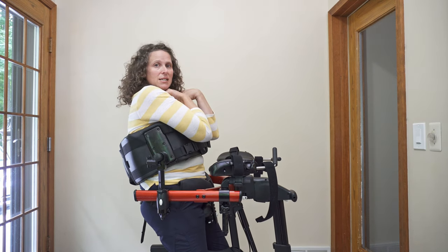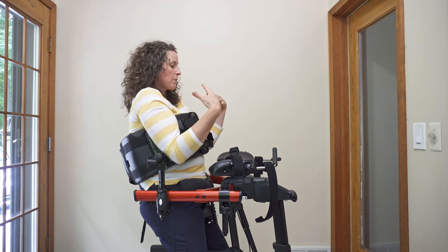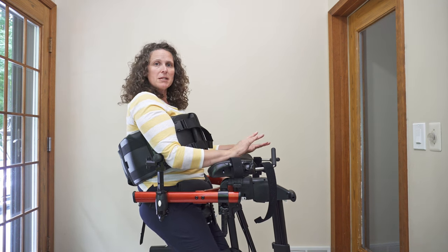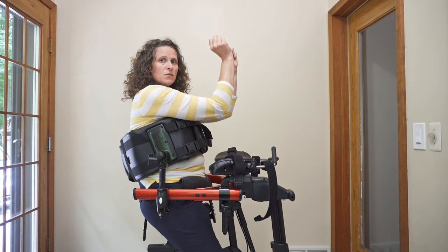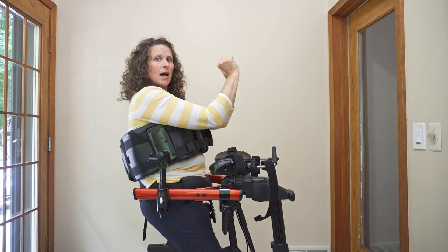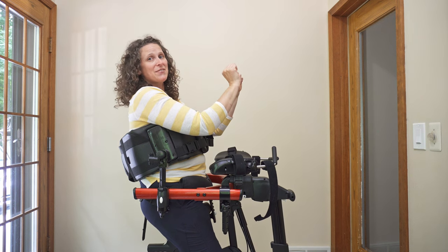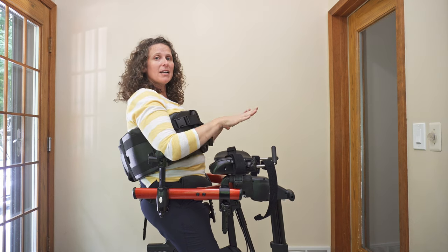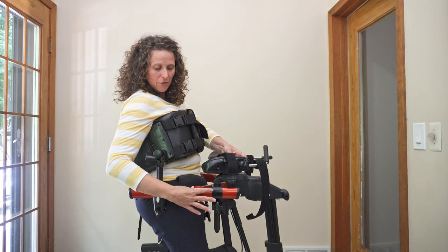Sometimes my students are still like right here, so I have to try to open this up a couple of different ways. First, I'm going to really try to get my arms in a better position, because if I can get my arms up here, I can really push with my arms and use active extension to open up the chest and lift up the head. In order to get my arms in a good position, I'm going to want to slide my arm prompts back on the frame.